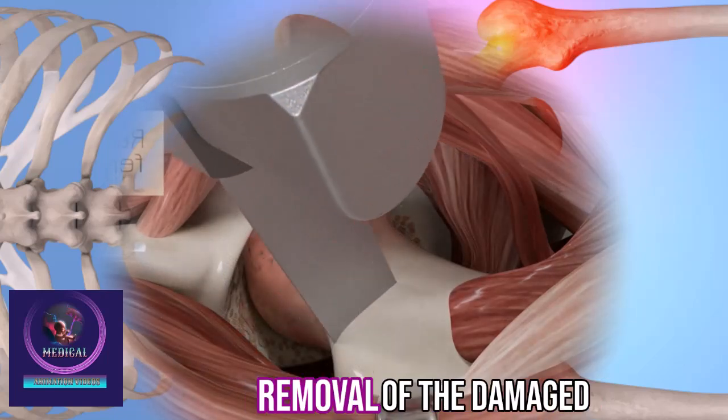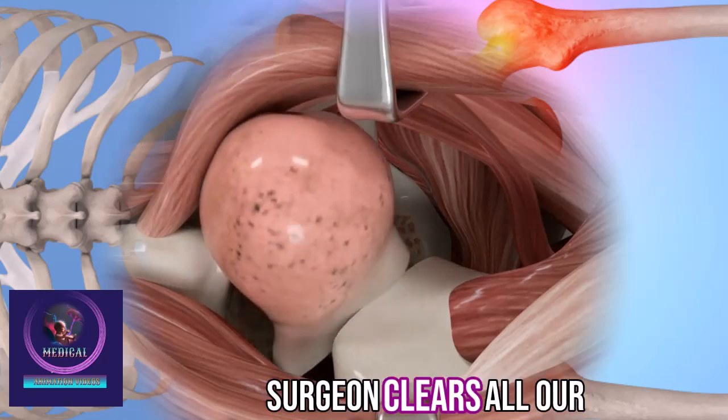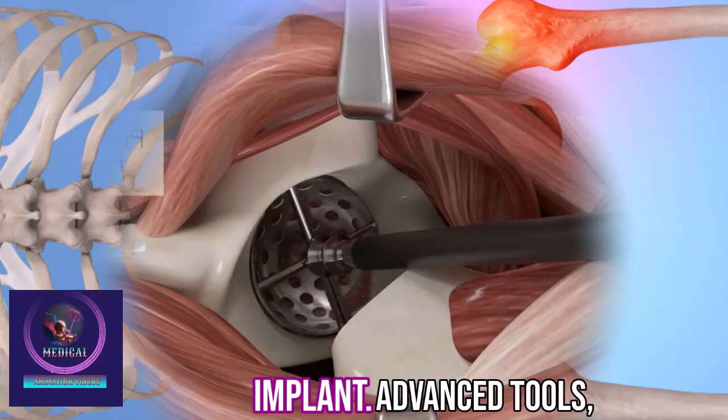The procedure begins with the removal of the damaged femoral head. Next, the surgeon clears all arthritic bone from the hip socket to prepare it for the implant.